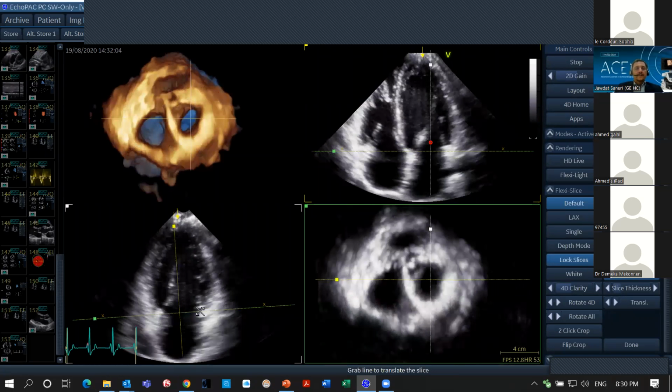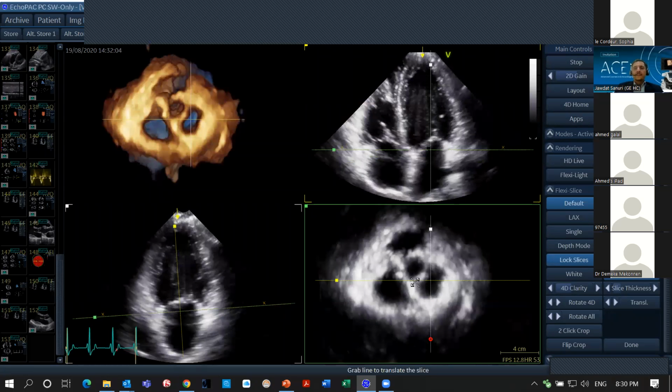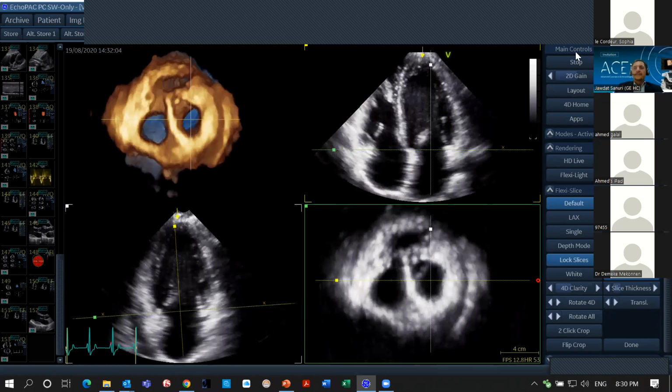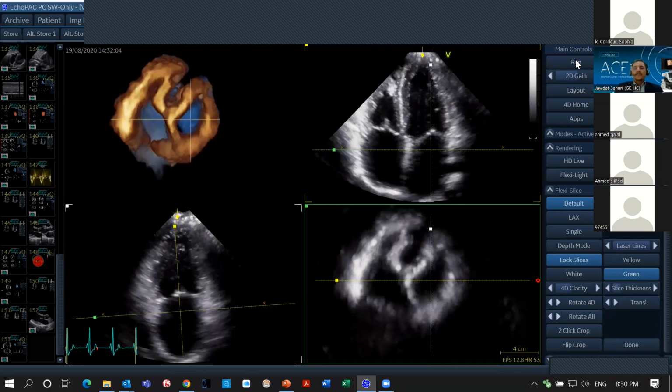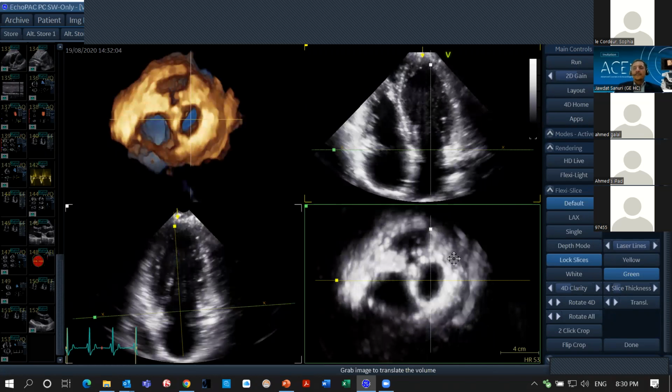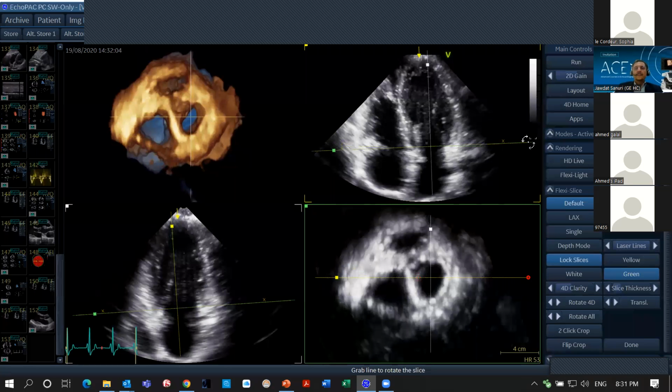For assessment of mitral regurgitation by continuity, it's very long. It will take a long time. I'm using, for example, aortic LVOT area, using 3D LVOT area, and then the VTI in the LVOT. And I'm using mitral ring area and the VTI in the mitral annulus. So I saw the best way is flex slice at the annulus level. But again, we have another method, which is the mitral valve MVQ. The ring area will not be very accurate there.